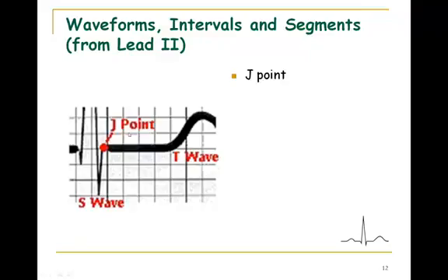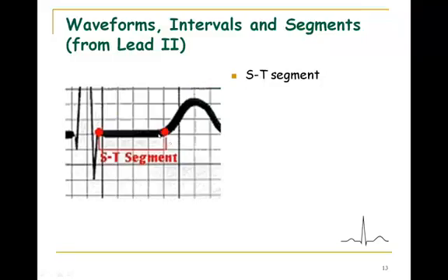This may be up here or down here. You're allowed a millimeter variance above or below, which corresponds to 0.1 millivolts, a positive 0.1 millivolts if it's up here, or down to minus 0.1 millivolts. That's considered to be perfectly fine. That's normal variance. But if it's more than that, there's something wrong. So this again is representing the ST segment.